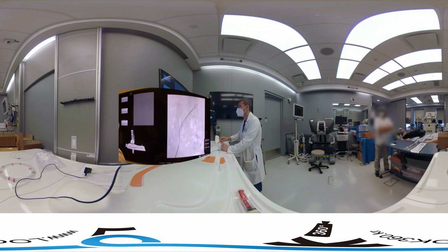So we're injecting here and see where we are. Back down, and there we go. And now we're in a branch that looks a little bit more like it's going in the right direction. We'll do a little injection here. Nope, that's a lateral sacral, so we'll come back. We'll try to find something different.